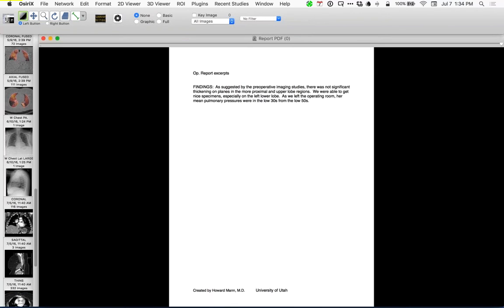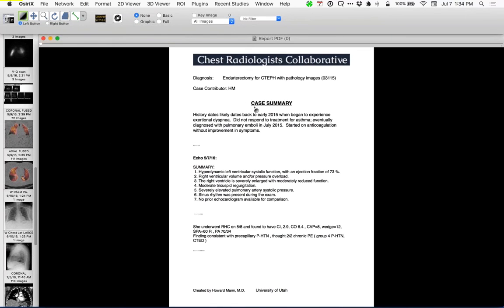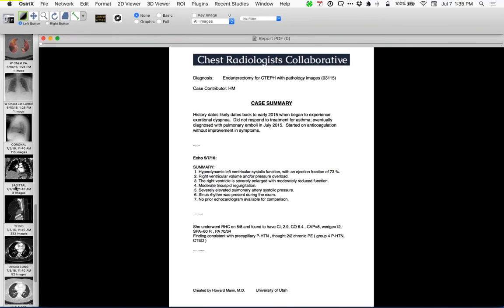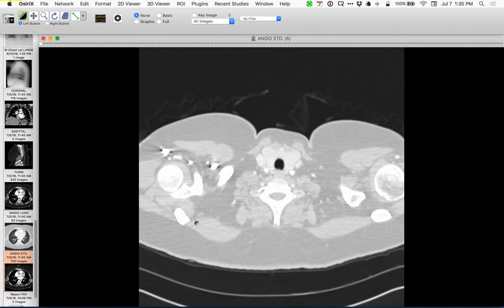So unusual, such a young person to get this thing. She's only 30 or so, but there's the history right there that I got. So what if she was on birth control pills, or she must have had a coagulation workup and all of that? I don't know. Yeah, I think she's 30. Very impressive. Howard, that's the first time I've seen this CT follow-up, and the regression of all the findings is just remarkable. Yeah, that's a really nice example, isn't it?